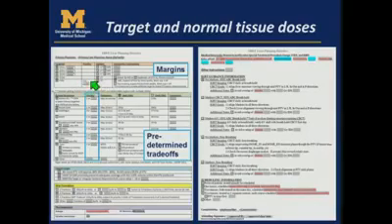So for example, if you want PTV coverage above anything else, you would put a priority 1 up here, and a lower priority for all the normal tissues. But I prefer not to overdose normal tissues, so I put priority 1 down here, and priority 2 is the tumor. So oftentimes part of the tumor will be underdosed in order to save priority 1 structures. It doesn't matter necessarily how you come up with your priorities, as long as they're written down, so different people aren't just guessing what should be done for each particular case, and so that they're very, very standardized.